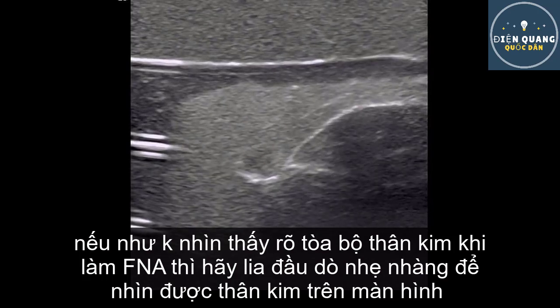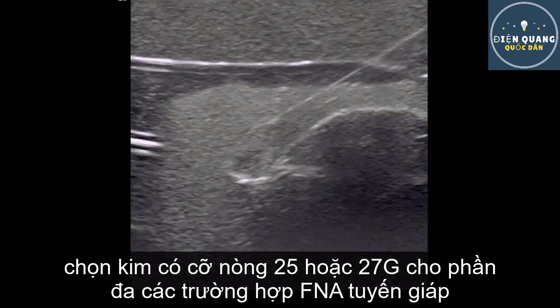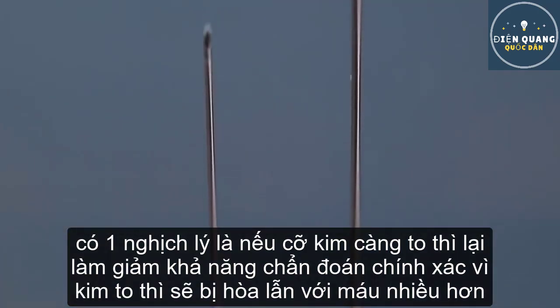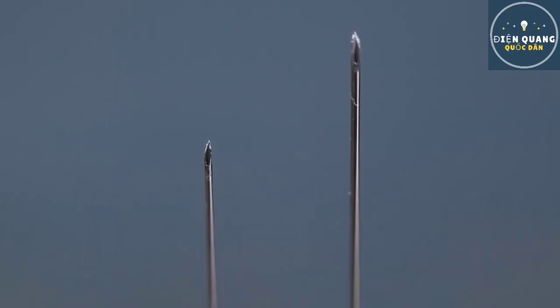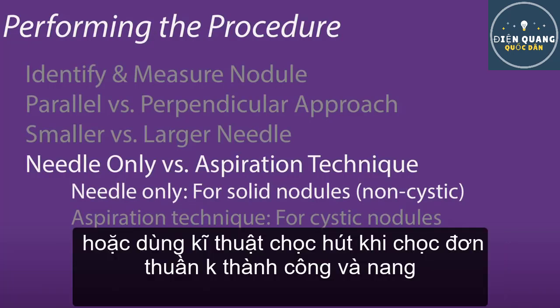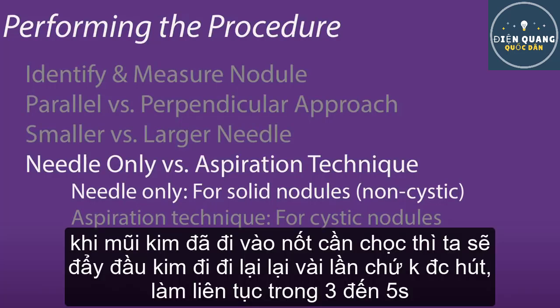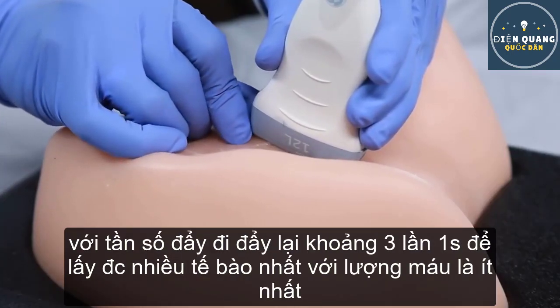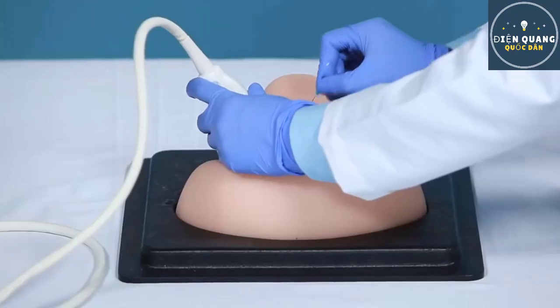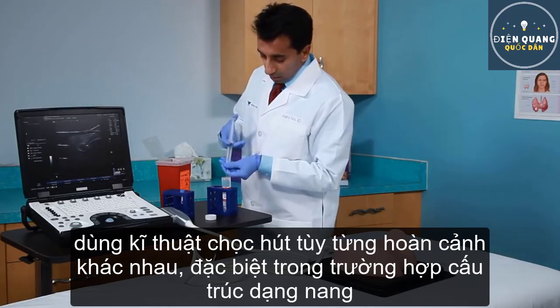If the needle is not visualized when performing the FNA procedure, remember to reposition the transducer rather than the needle to see the image on the screen. Use a 25 or 27 gauge needle for most thyroid FNAs. Larger needles paradoxically increase the chances of a non-diagnostic specimen, since the larger diameter leads to dilution by excess blood. Most experts recommend starting with the needle-only technique for solid non-cystic nodules to avoid excess bleeding. One can always perform the procedure with aspiration on subsequent passes if unsuccessful. Advance the needle into the nodule and move it back and forth for 3 to 5 seconds, about 3 times per second, to get the most cells and the least blood. Do not apply suction. Put the sample in the collection tube.